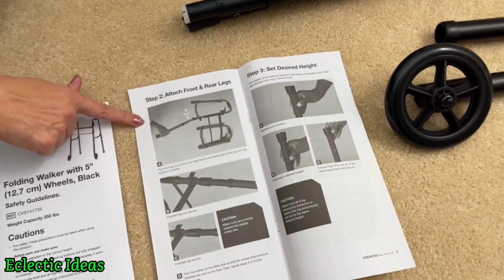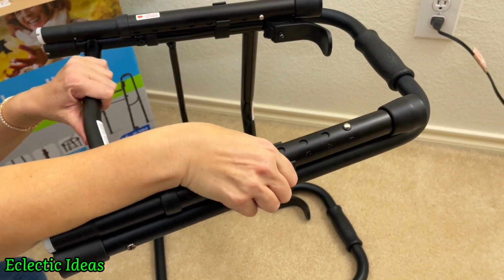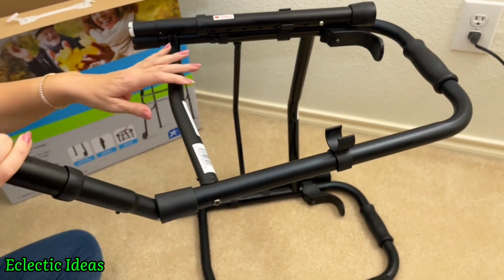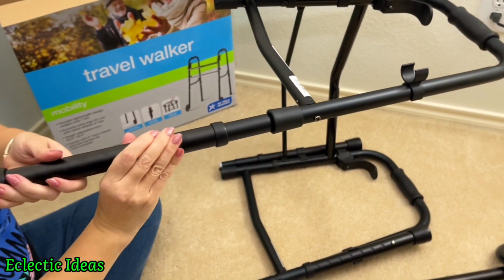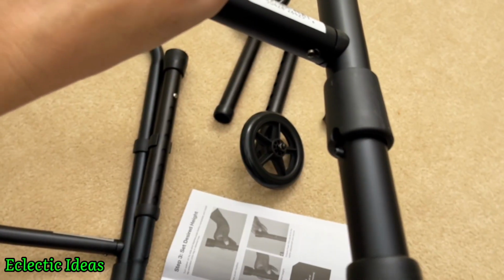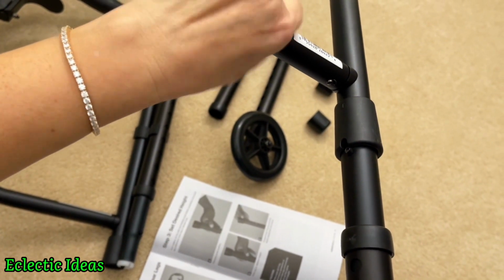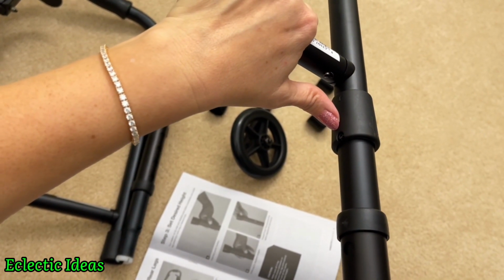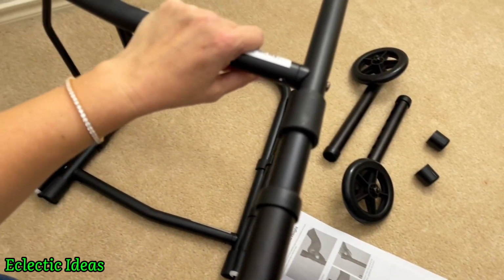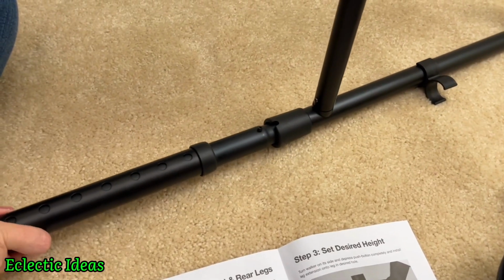In step 2, we're pulling your leg. Not really. We're just going to go ahead and unsnap the bottom part of the leg from this clamp. When the bottom leg gets to a certain position, it just kind of hops into place. And then you're going to twist. And on this side right here, there is a little notch and pin. You have to line the notch and the pin up until they snap into place. Like so. And then we have to do it to the other side or your walker's going to have a limp. We don't want that. Snap that in there firmly.